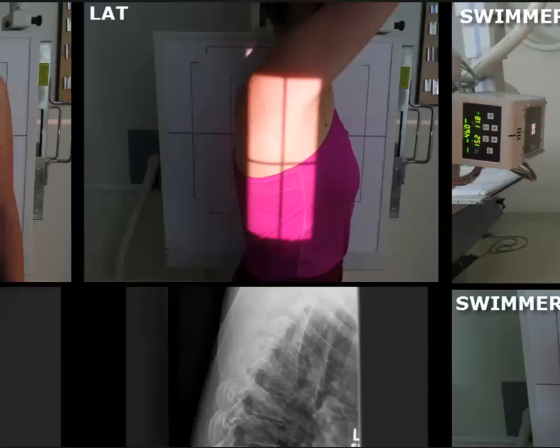Some people might want to palpate on the back of the scapula and find the inferior border of the scapula. Also, some people will use a reference of approximately 3 to 4 inches below the axillary region. Typically, I just leave my central ray exactly where it was with the AP and turn the patient into a true lateral. And if we got the AP, we will most certainly get the lateral as well. Once again, it's very imperative that we collimate from front to back here. We want to reduce as much scatter radiation as possible and leave our collimation from top to bottom open.